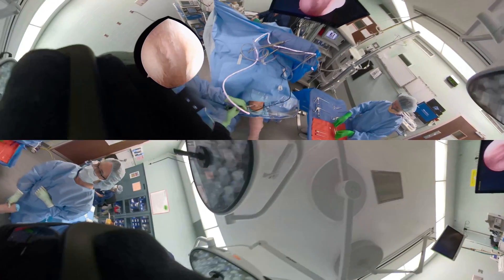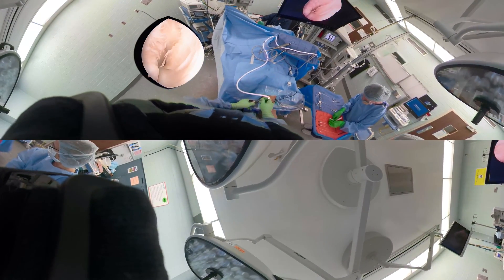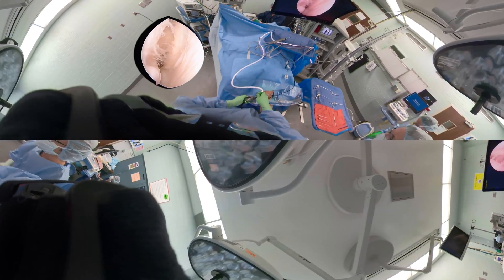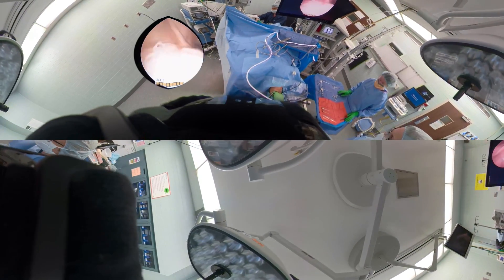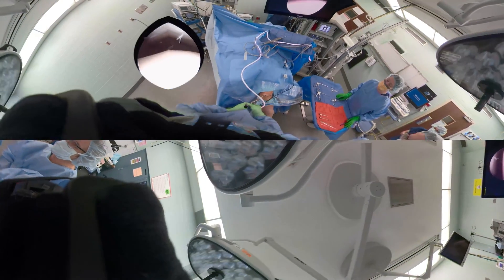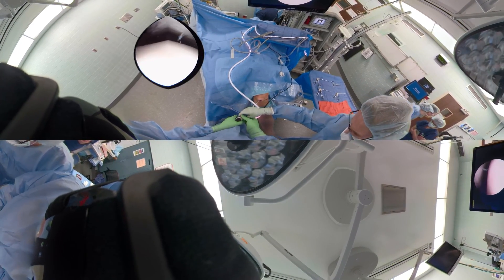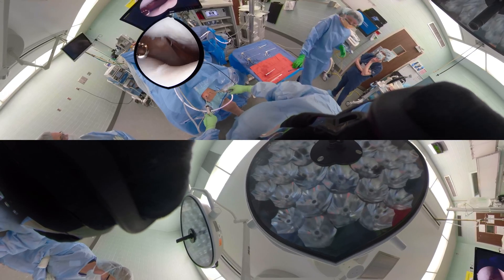The scope is now in the medial portal. When you change your scope to another portal it is better to use a cannula obturator as opposed to putting the camera directly in, because you can ding the tip of the camera and have to send it off for buffing. Now we're looking through the medial portal for the donor lesion — where did that loose body come from? It came from the medial patellar facet.